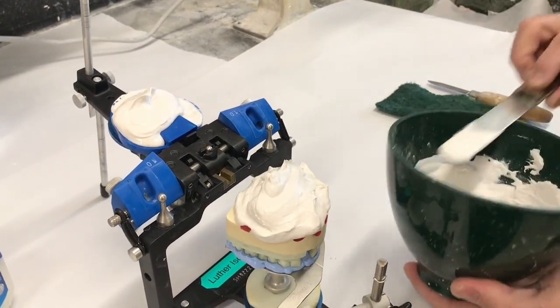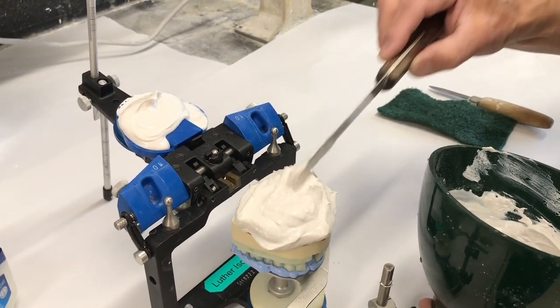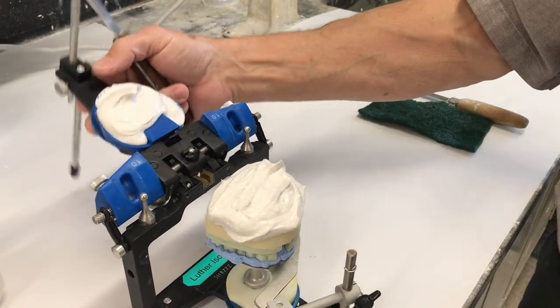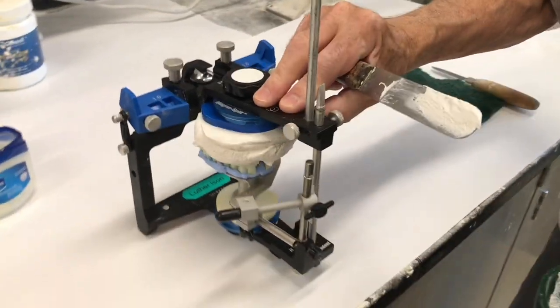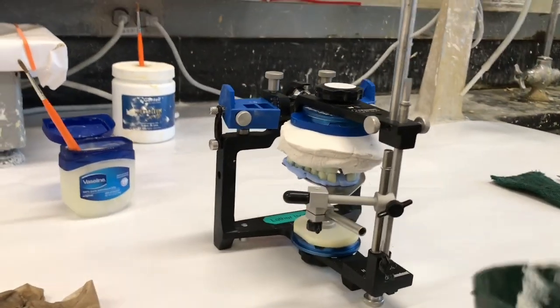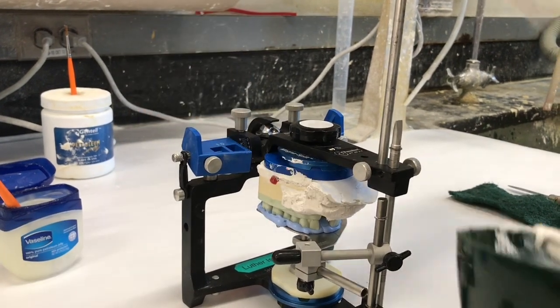We may want to electrical tape this back on if we have to remove the cast from the mount. I want it fully covered that way. From here I can close it down all the way until the pin is on the table. I've got way excess plaster, but I can take and remove that.